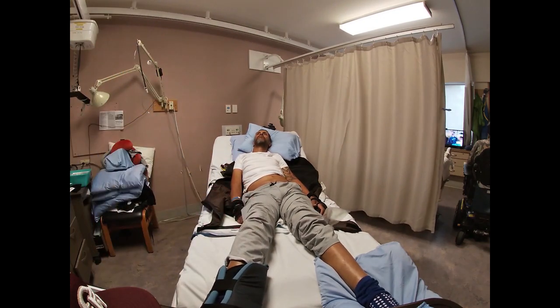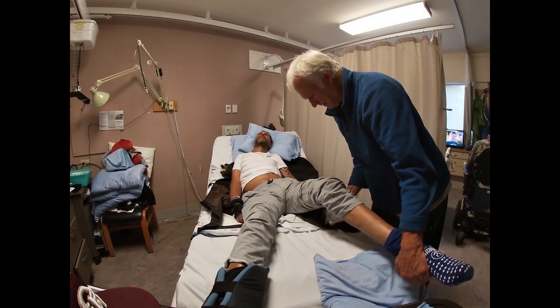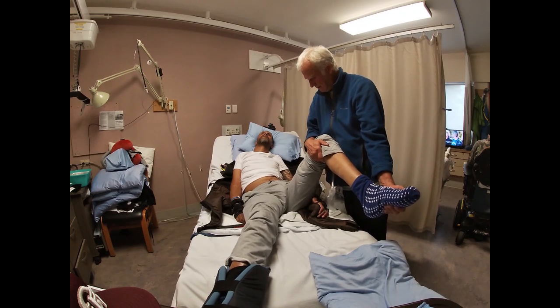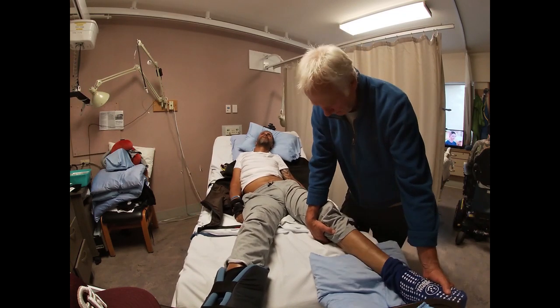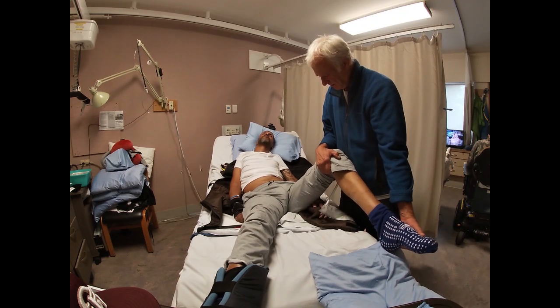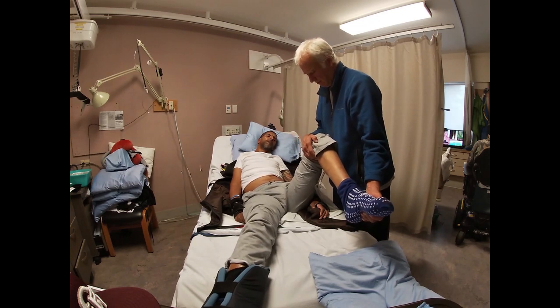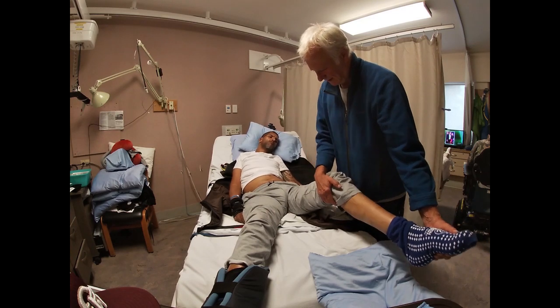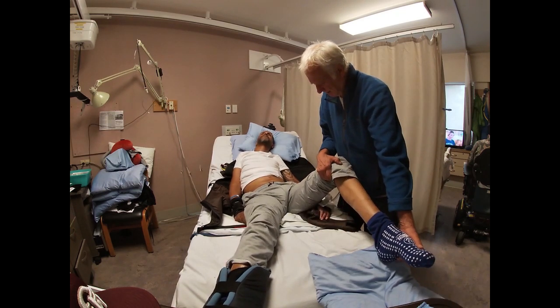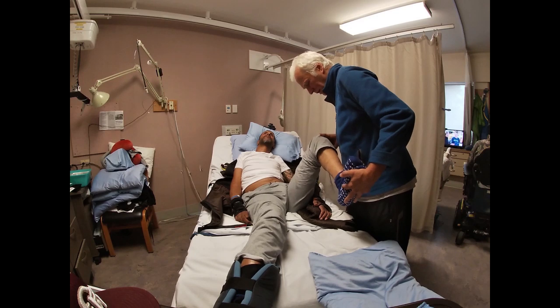Okay, we're going to do that same thing on the other side. Okay, in your mind, bend the knee. Bend the knee, in your mind. That's it. And push down. Good. And bend the knee, in your mind. Good. A lot easier. Don't have to fight him as much. And now push the leg down. Push it down. That's it. Good. Okay. Now again, in your mind, bending the knee. Good. And push it down.